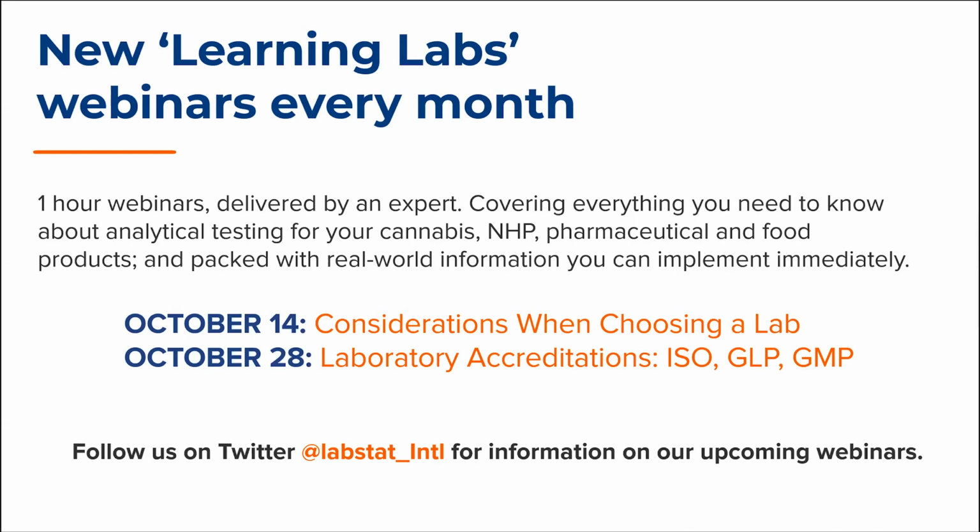So Devin, we have another question that says, do you know the Health Canada requirements for testing topicals? I am not at this point very familiar with the requirements around testing topicals as far as what is actually required. At minimum, you will be required to verify the potency of the active ingredient in that topical. That potency method will need to be validated, and that validation will follow the guidance that I provided in this webinar.